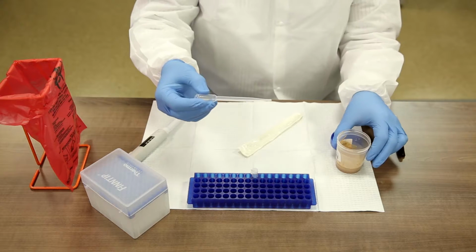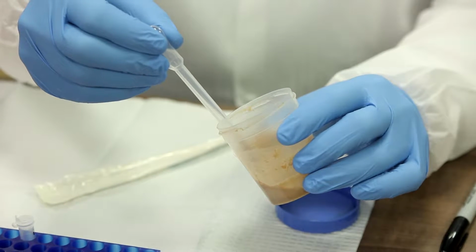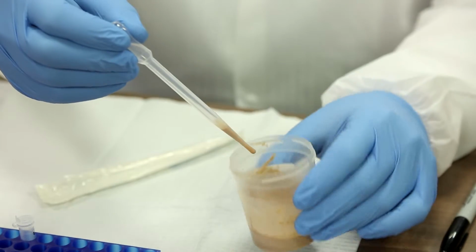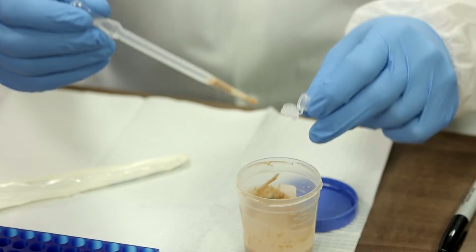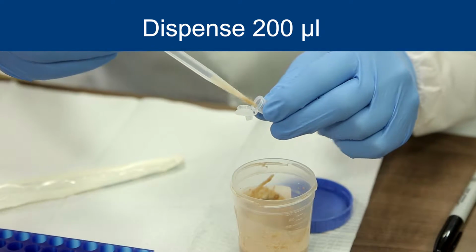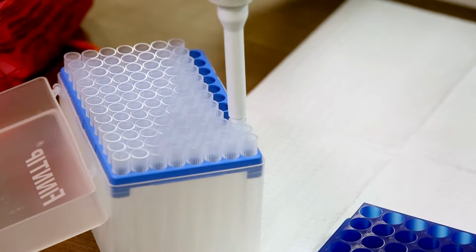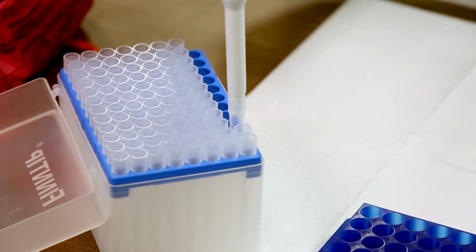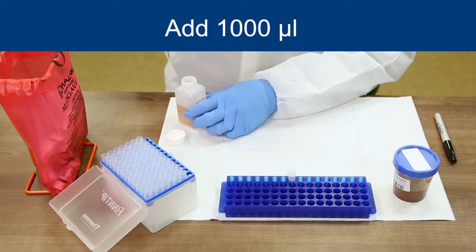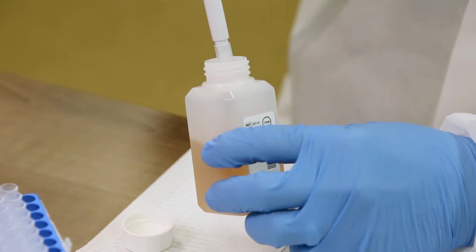For a liquid stool, begin by homogenizing the stool specimen by sucking the specimen in and out of the transfer pipette. Using the same transfer pipette, dispense 200 microliters of liquid stool in a clean centrifuge tube. Using a pipette with disposable tip, add 1,000 microliters of pre-treatment reagent, R1, to the centrifuge tube.